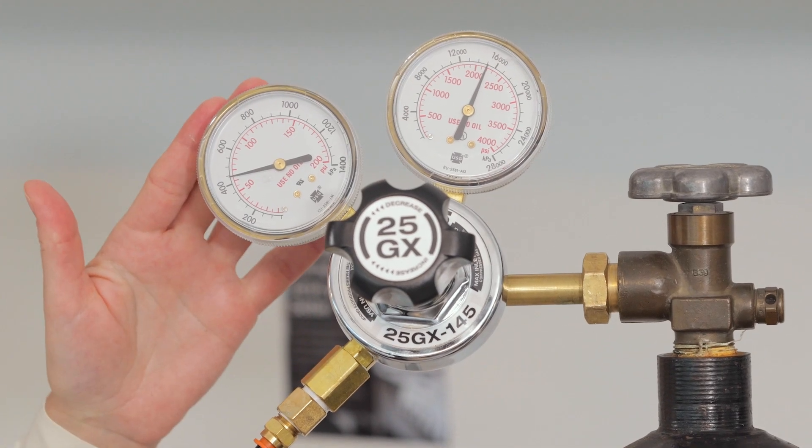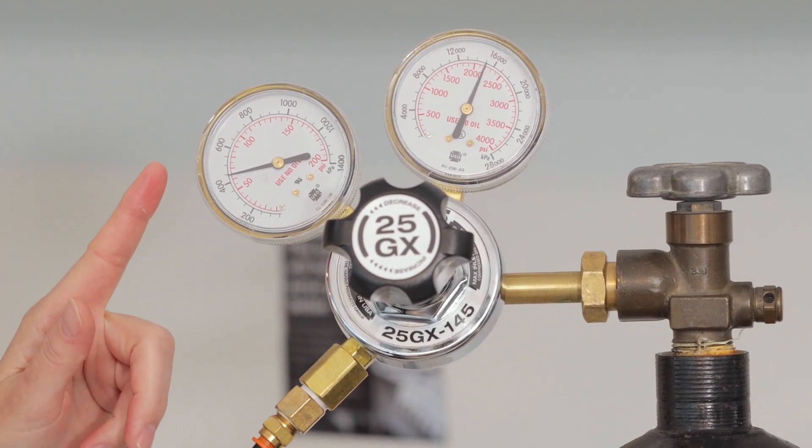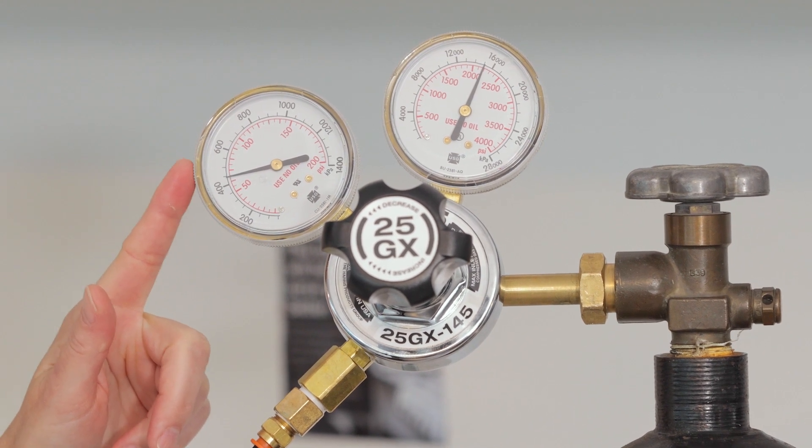We recommend the pressure to be around 60 to 70 psi. Please note that it is the inner red dial to be looking at when you read the number.